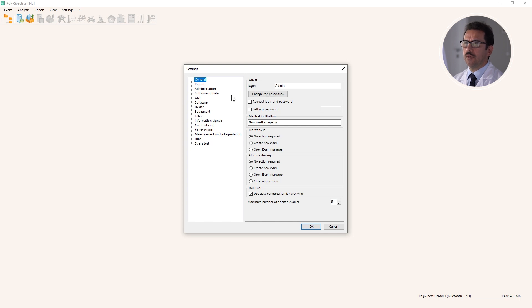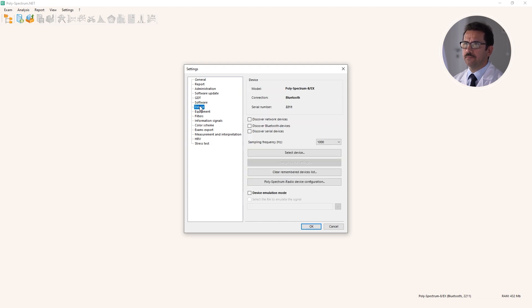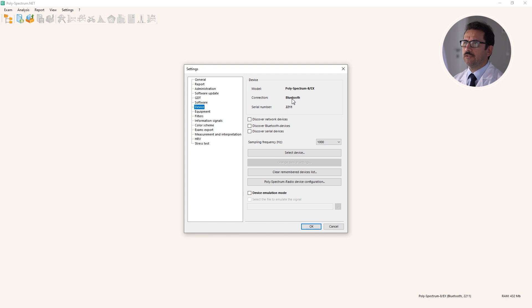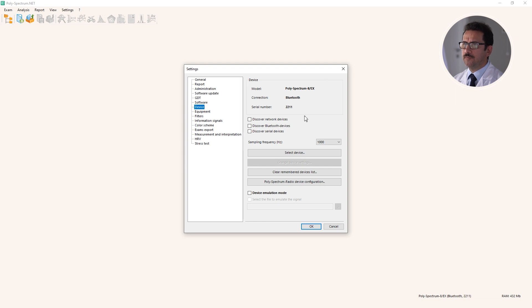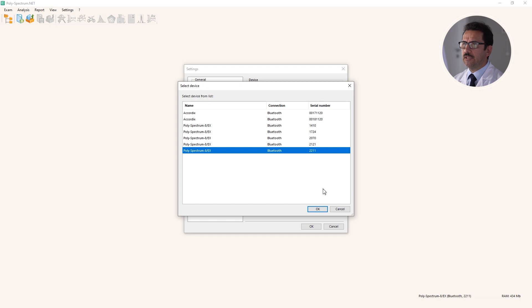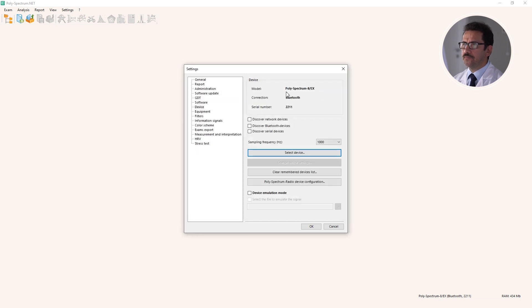First of all, this device - we have a Polyspectrum EX device connected via Bluetooth. If you want to change the device or change the parameters of the device, we go to this window. For example, we can use the device selection option, and also we can change the sampling frequency for the device.